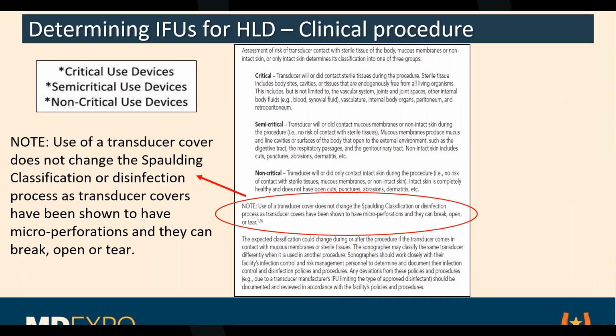But the issue is the FDA maintains and has objective and empirical data to support this, that those sheaths tear sometimes while they're inside the patient. Then there is contact. So therefore, because it's a non-zero risk procedure, you have to do high-level disinfecting, even if you use a sheath. And there's a lot of pushback on that from the medical communities.